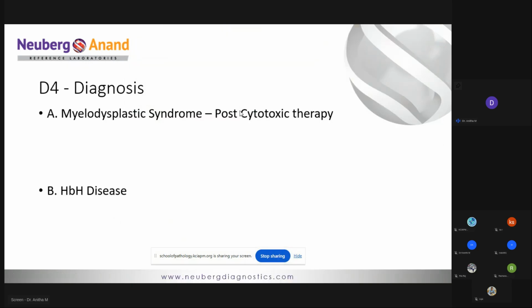So the diagnosis: the first case we went ahead and requested for marrow. Marrow was done, and it was MDS. She had a TP53 mutation. Initially, there were a lot of ring sideroblasts when she was just MDS. Later, she progressed on to acute leukemia of erythroid differentiation. We didn't find the ring sideroblasts that time. But again, once therapy was started, the ring sideroblasts appeared.